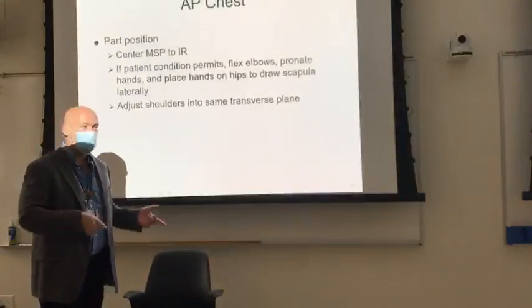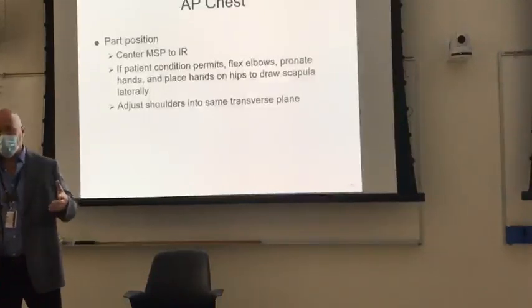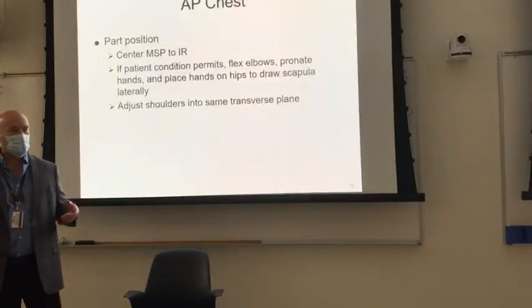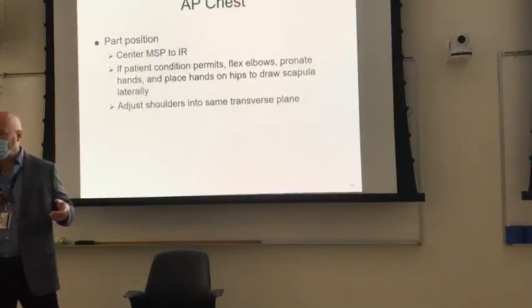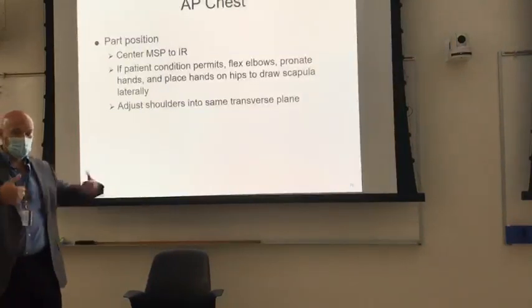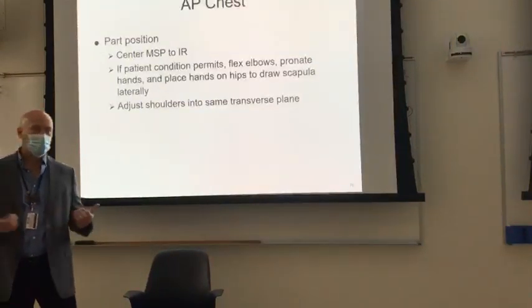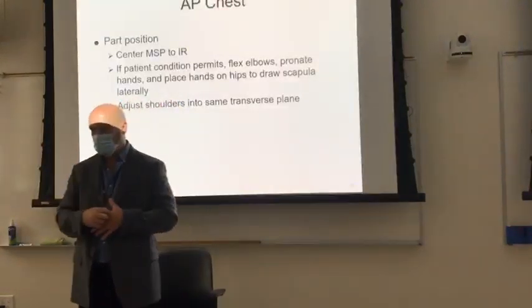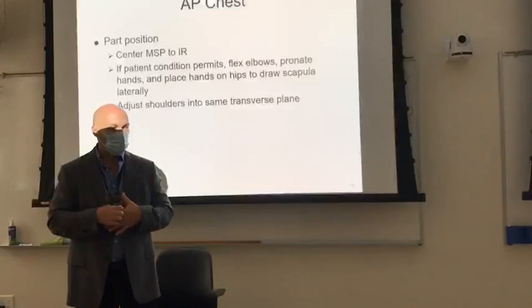The reason I shot that one PA was because I happened to come into the patient's room, he was sitting up on bedside. He really could come down to the department. He was eating his breakfast, and he just finished. I moved the table out of the way. I said, just hold on to this, and I shot him from the back. So one PA chest in my entire career that was portable. The rest of them were AP.